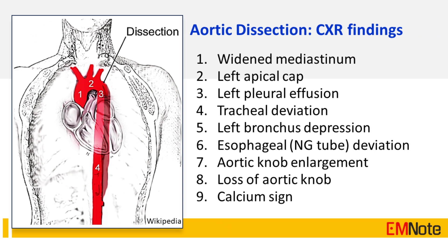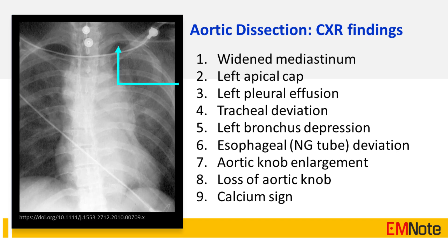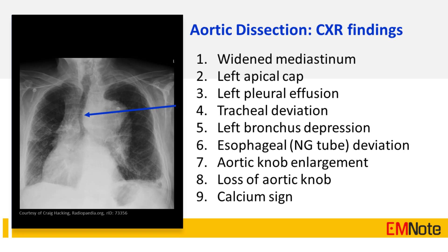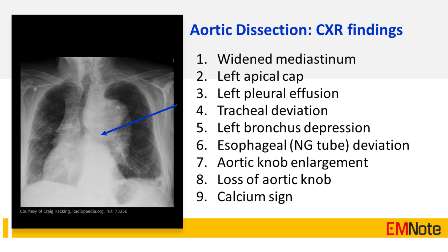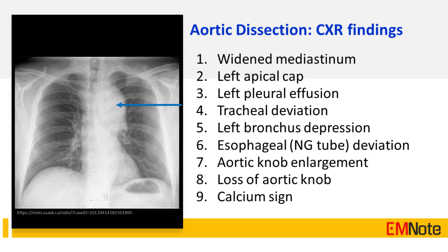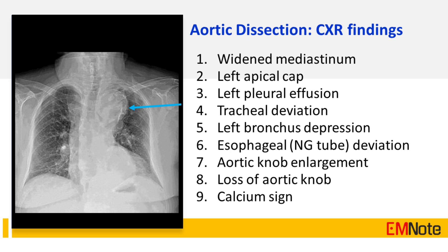In summary, the 9 chest x-ray features that suggest aortic dissection include: 1. Widened mediastinum. 2. Left apical cap. 3. Left pleural effusion. 4. Tracheal deviation. 5. Left bronchus depression. 6. Esophageal or NG tube deviation. 7. Aortic knob enlargement. 8. Loss of aortic knob. 9. Calcium sign.